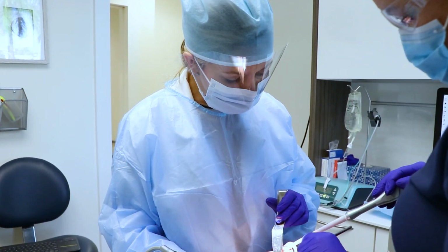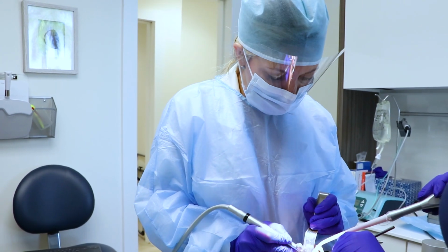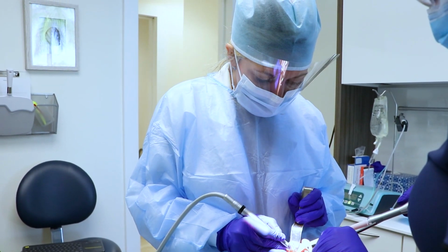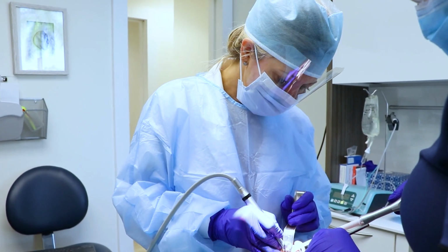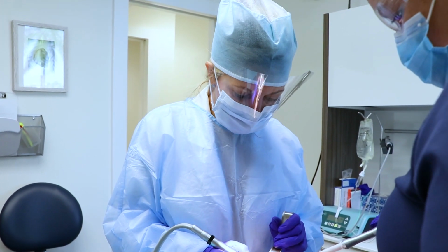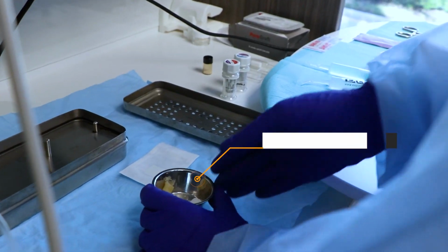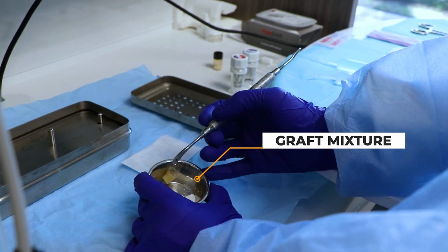The bone is then micro-perforated so that we can stimulate bleeding, because bleeding is what heals everything. And so we need a blood supply in order to grow the bone, okay? So once I do the micro-perforation, then I can mix the 3 types of bone graft material together and the PRF. So here we have 3 different types of materials, and we're going to add PRF.